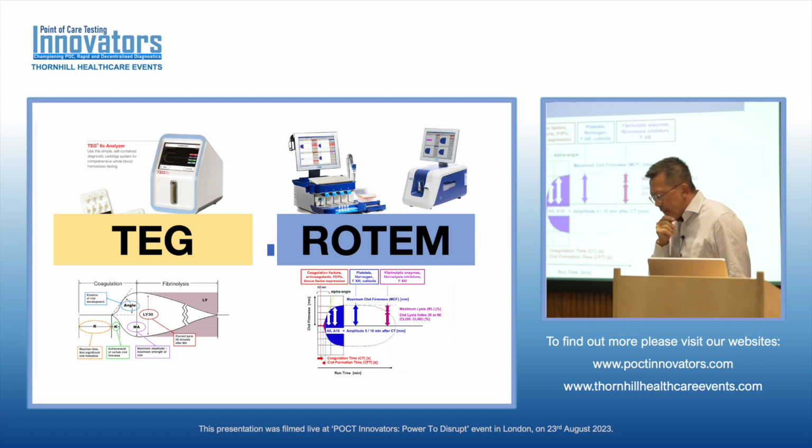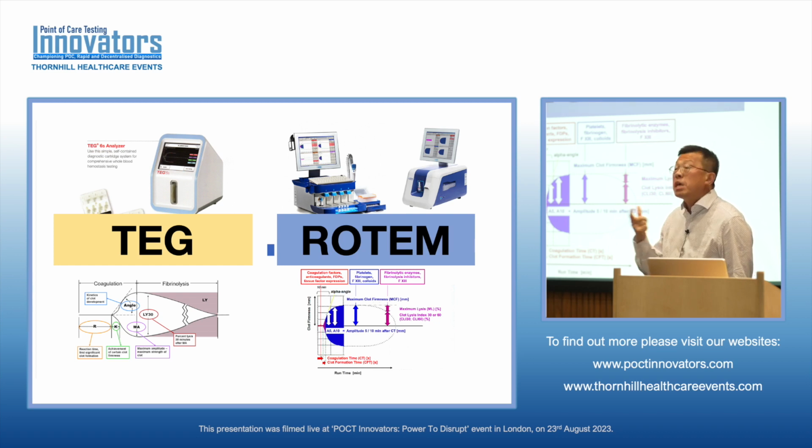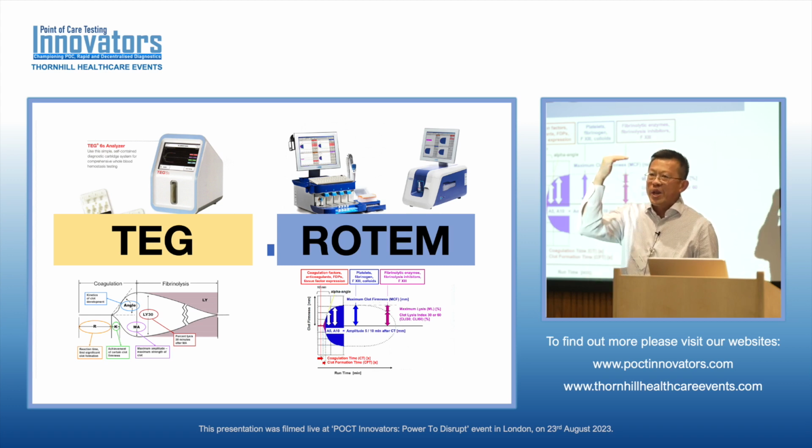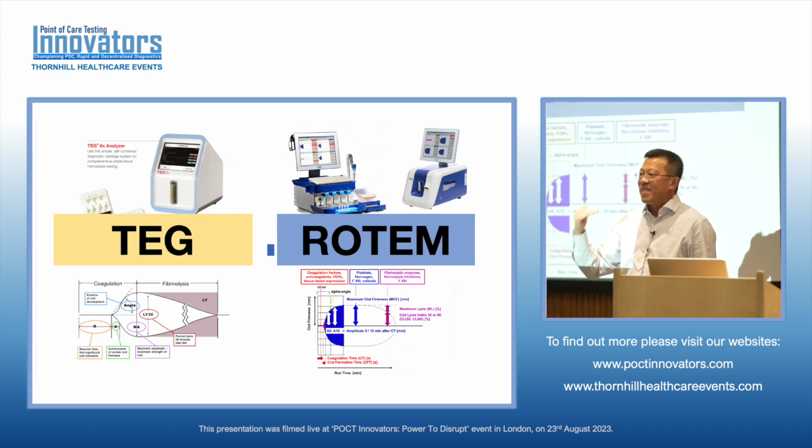But the one thing I would say is that I know that some laboratories, and many hematologists, are very skeptical or very uncertain about viscoelastic testing because it's not part of their training, it's not part of their education, it's not part of their day-to-day management. But I tell you, the people that will tell you that this is the way forward are the people on the front line managing the patients, the surgeons standing there, giving the reassurance that I've just tested your blood, it's deficient in this, we're going to get this, and this is there, and that's fine. I can see the blood clotting now, okay?